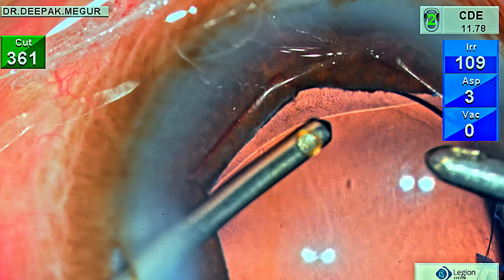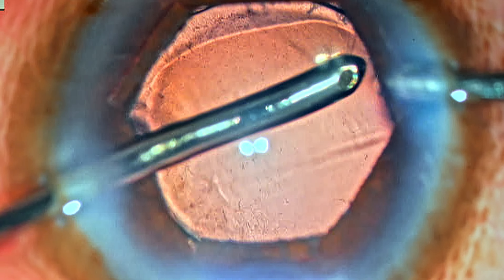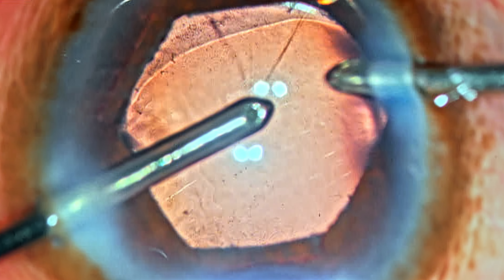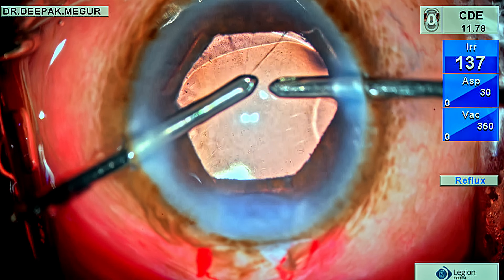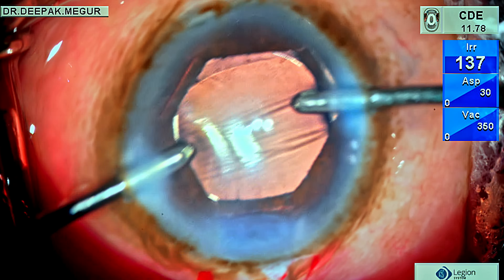As I try to remove one last bit of cortex, the vitreous peeks in again — it's quite tricky to disengage this vitreous fibril from the aspiration port. I need to press the reflux button a couple of times before it disengages, then I remove the aspiration port and swap it with the vitrectomy cutter, and cutting begins again.